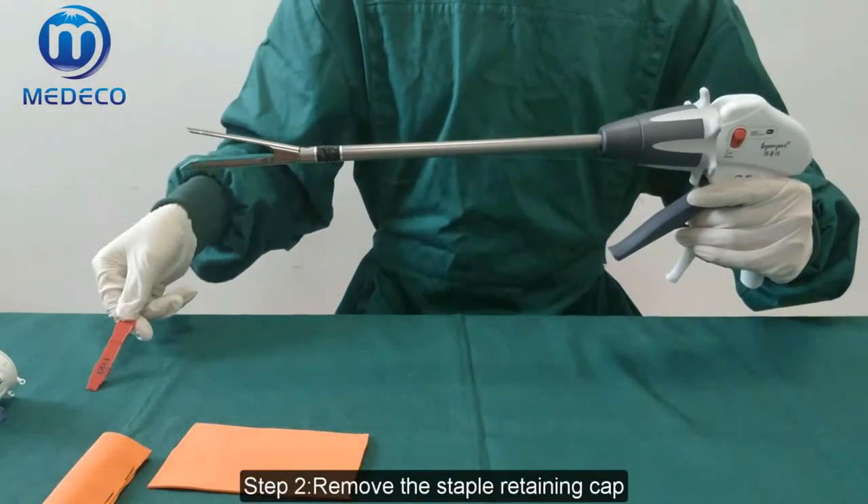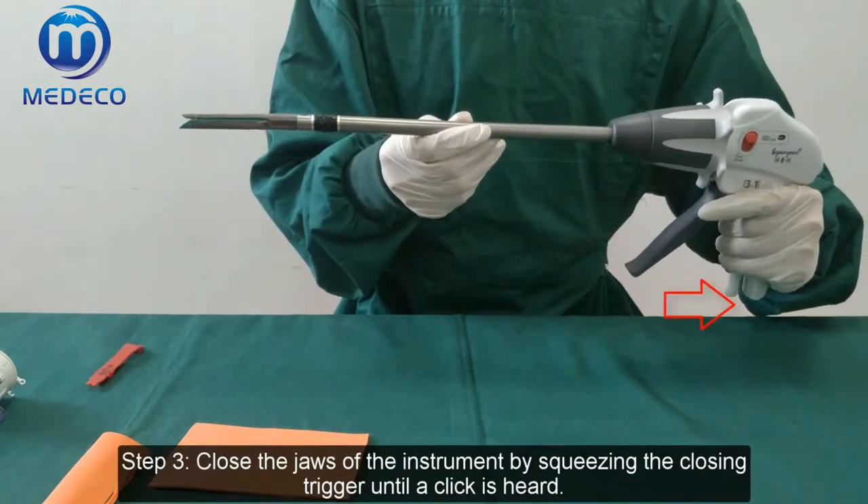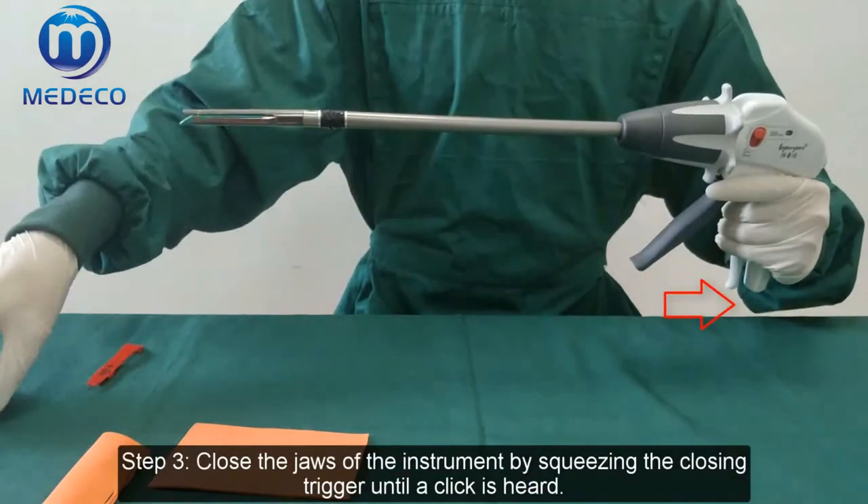Step 2: Remove the staple retaining cap. Step 3: Close the jaws of the instrument by squeezing the closing trigger until it clicks and hold.